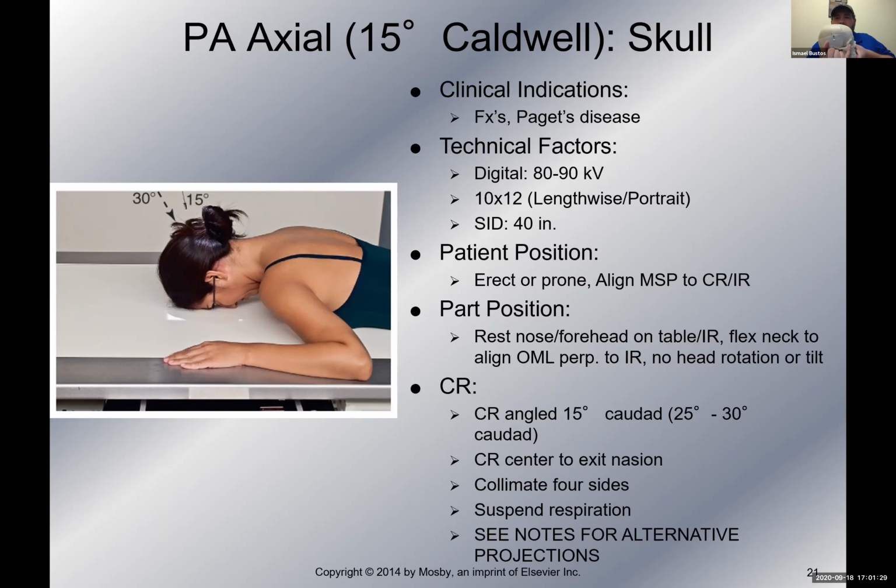That OML there needs to be perpendicular to the image receptor. So what am I going to have to do? Well, I'm going to have to flex the head to bring that OML perpendicular. So we want to make sure that we put the nose and forehead on the image receptor. That'll help bring the OML down perpendicular to the image receptor.